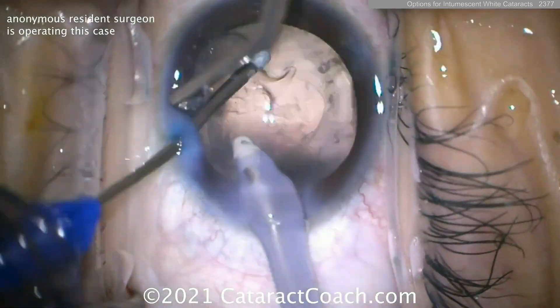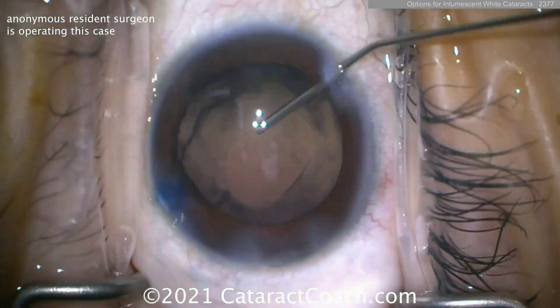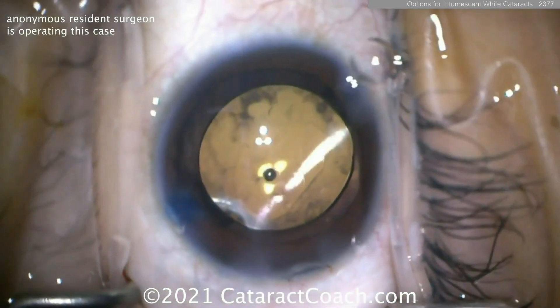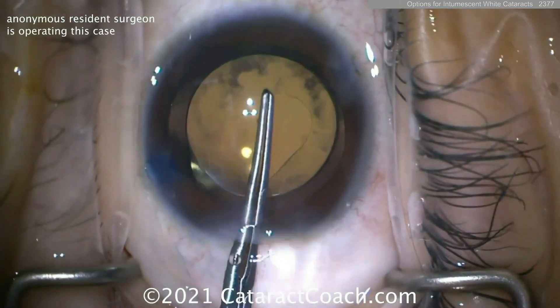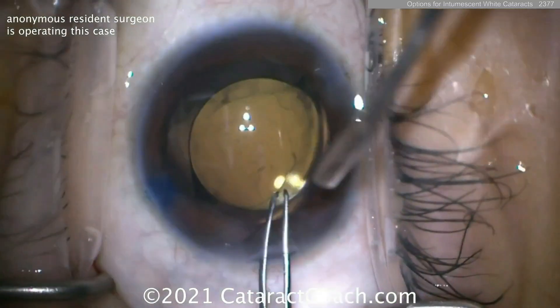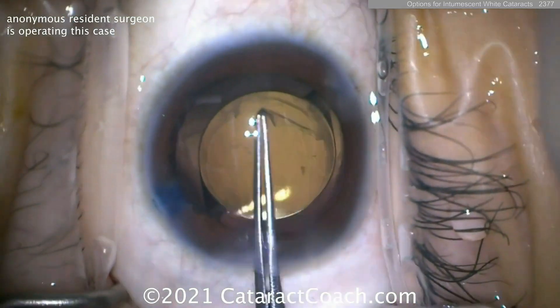Then we can enlarge the rhexis to the size that you want. So here the lens can go in the capsular bag, and you don't have to leave the ugly rhexis — you can now enlarge it and have a nice, pretty five-millimeter rhexis, and the patient has a beautiful outcome: nice, safe, and easy.